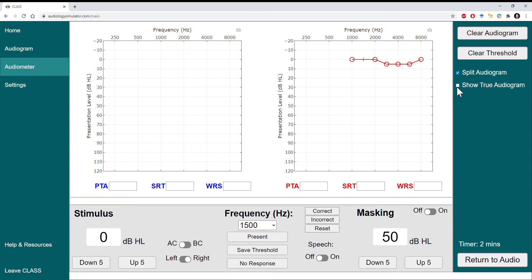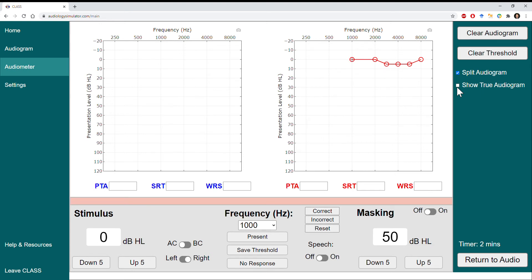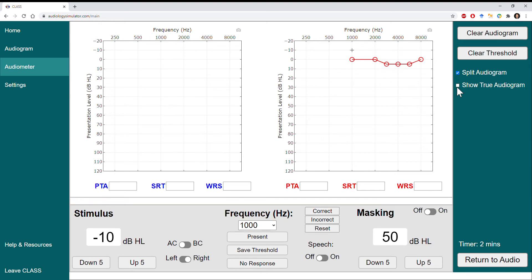It's common practice to return and recheck 1000 Hz, and it's not a bad idea to confirm this yourself. At default, the program will always keep the exact same thresholds, but in the Settings tab you can modify the patient response variability, and it can be a good idea to reconfirm your 1000 Hz threshold just to be sure.